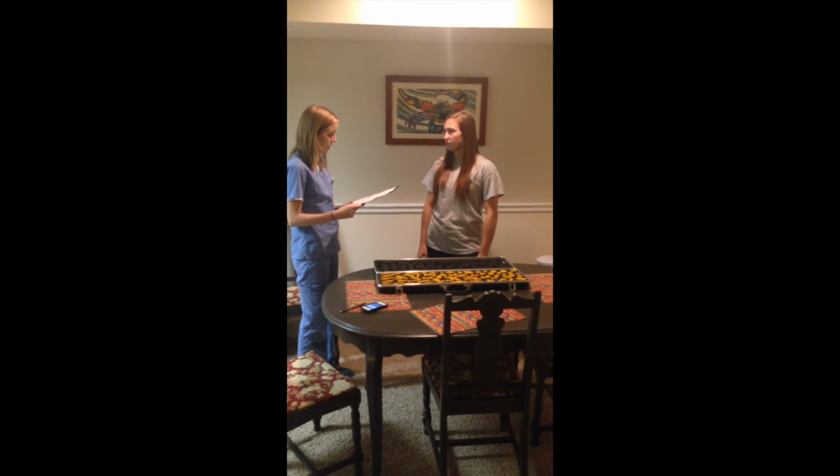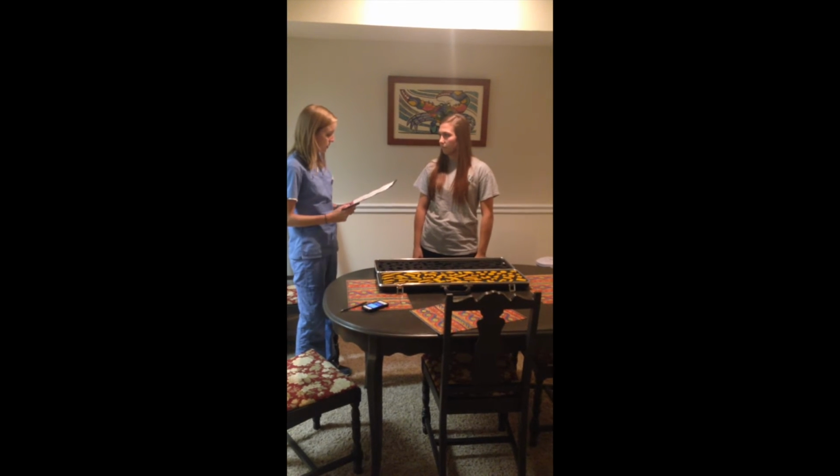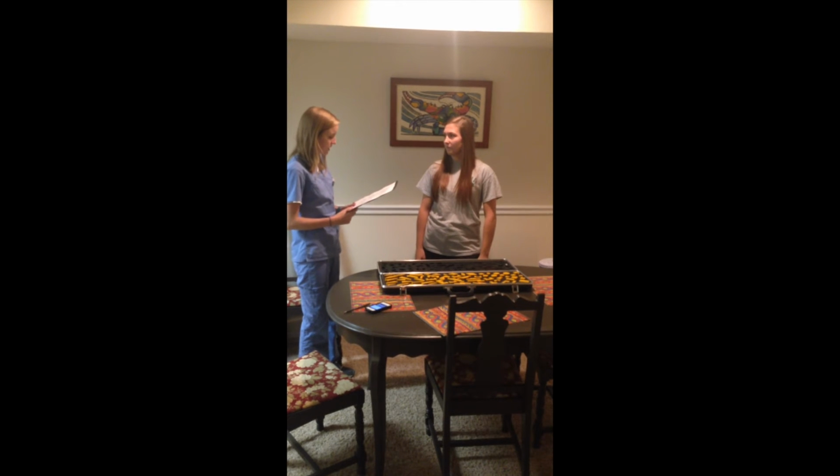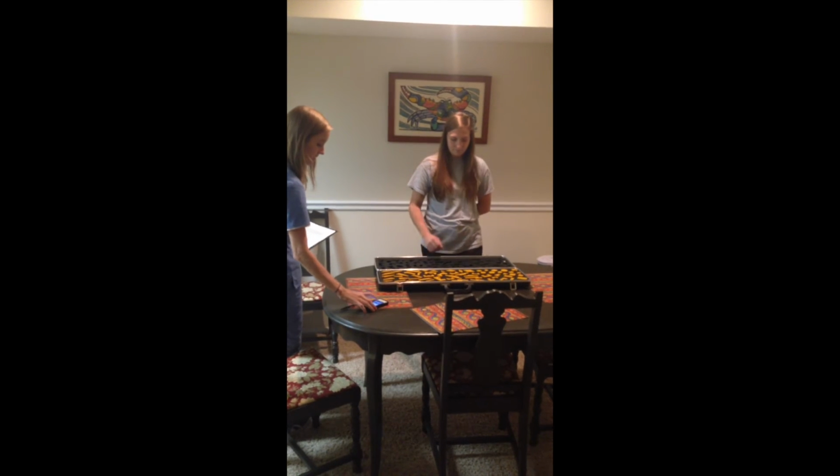When I say go, work as fast as you can to put all the blocks into this board. Remember, use only one hand and keep the yellow side of the blocks up. You ready? Go.